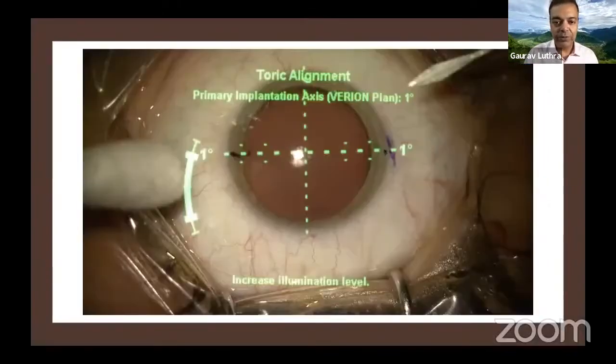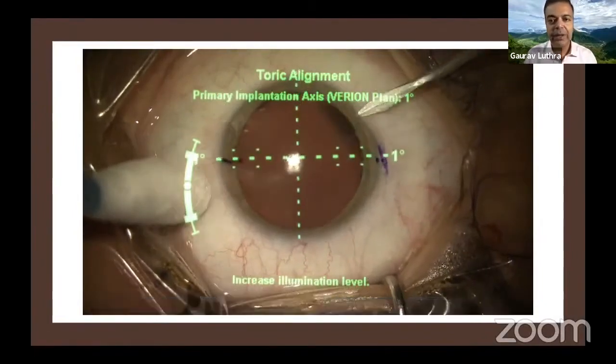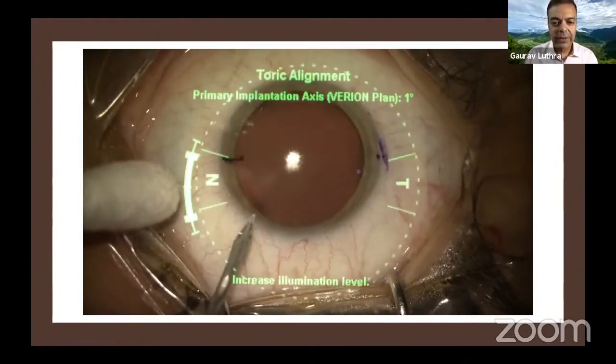Now let me take you to another small situation where, here, this is a patient, I think, where we are planning to do an ICL. See how easily the side port blades go. It's a nice Mani blade which is being used.